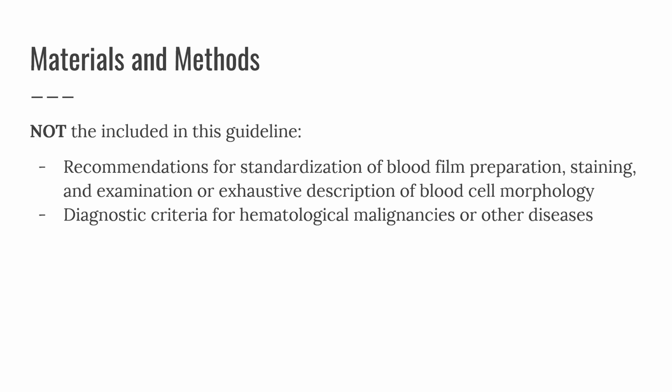Not included in this guideline are recommendations for standardization of blood film preparation, staining, and examination, or exhaustive description of blood cell morphology. Also, we will not be discussing the diagnostic criteria for hematological malignancies or other diseases.